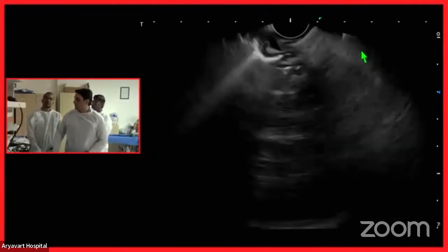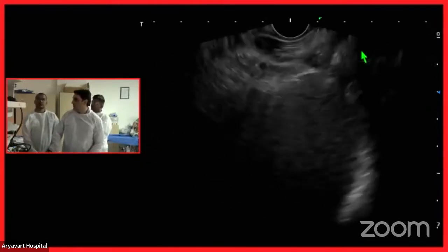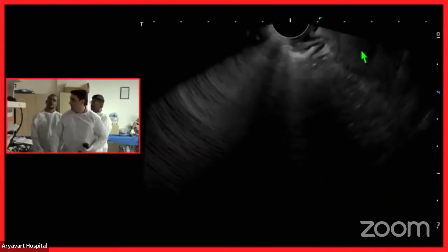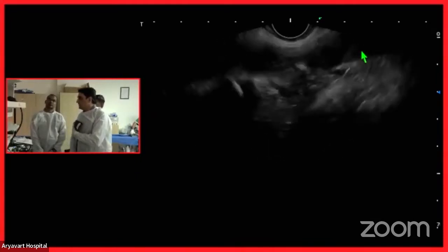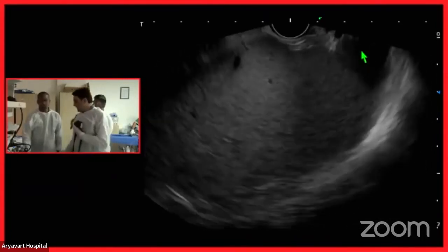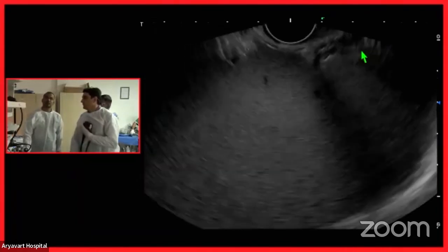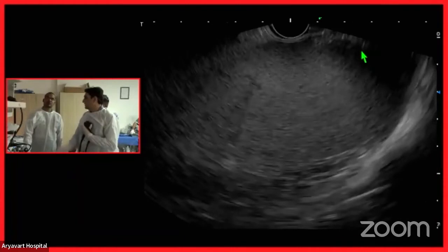When I rotate anti-clockwise, we can see that the spleen was already enlarged. This is aorta. So I'll rotate a little bit more to push the scope down. And when we rotate a little bit more, we can see that the spleen is seen. And I could not see any ascites there also. And the spleen size is enlarged. So can you zoom out? Yeah. Zoom out. So you can see the spleen is not coming in even after great magnification. So that means it's enlarged.